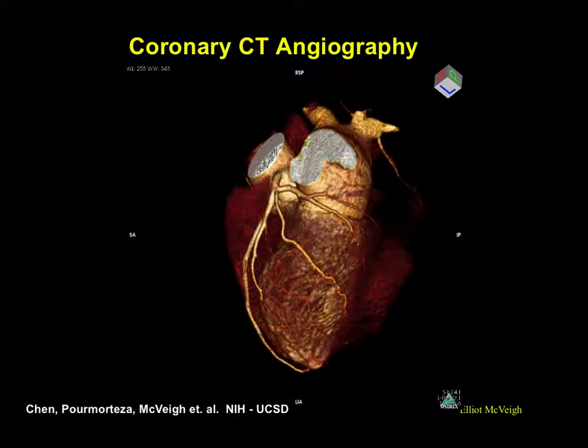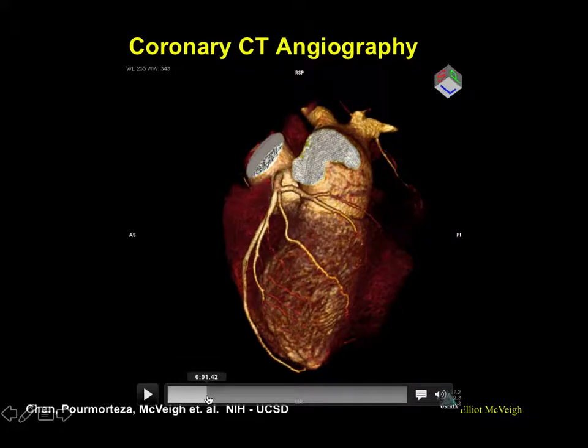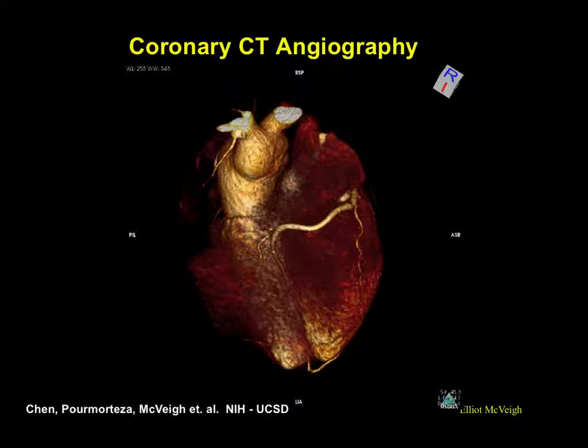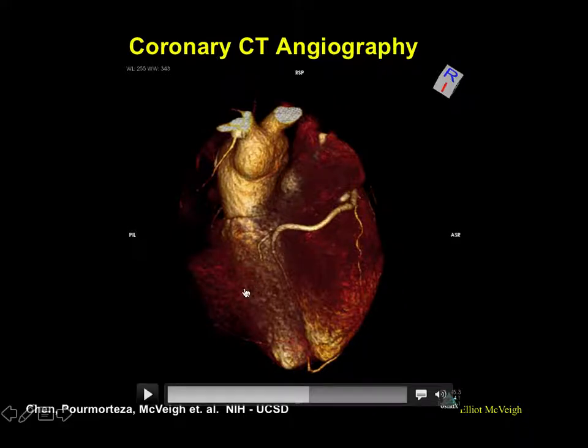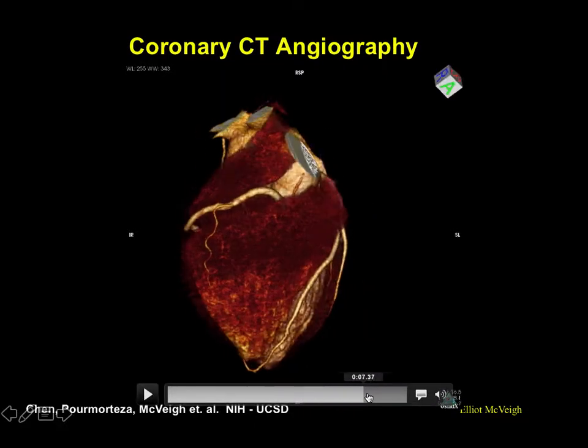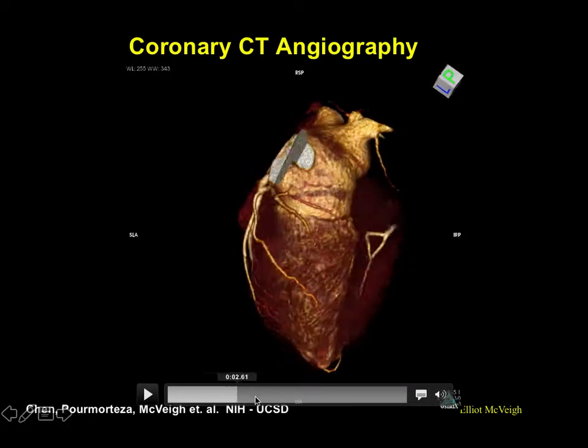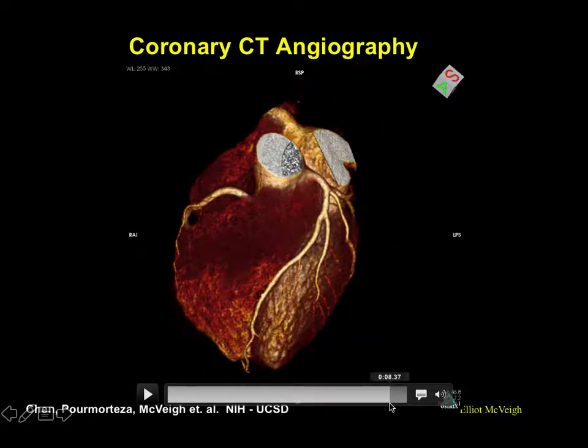If, on the other hand, when you did this 3D view, you turn around and the RCA just breaks up into a noisy bit of mess, then you know there was motion, or there was some other reason why we didn't get good pictures. We have to deal with that problem first, right? So that's usually what these are used for, and they're also used for marketing, you know, for just showing this technology is crazy good.